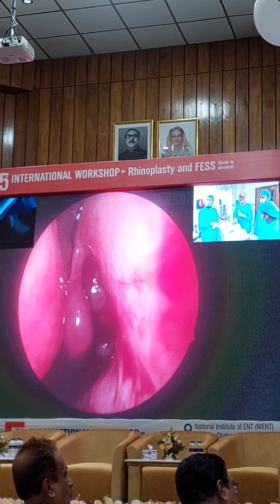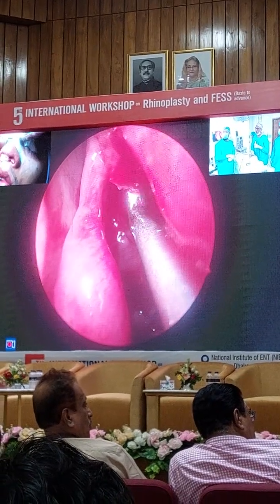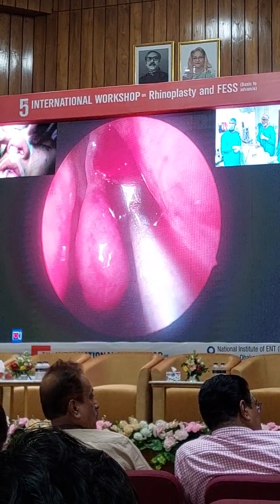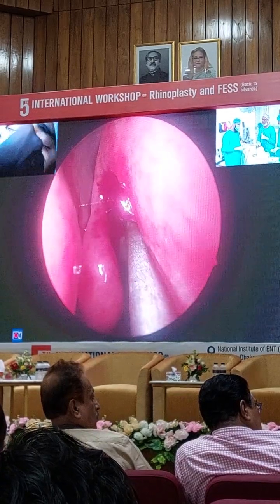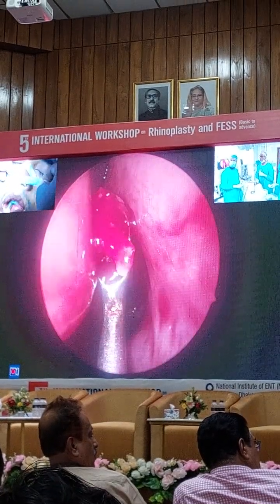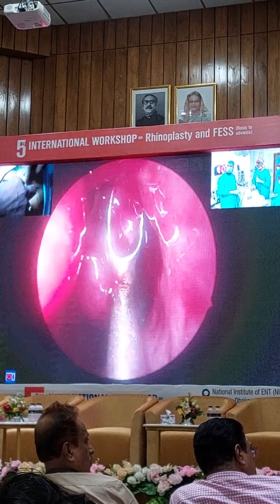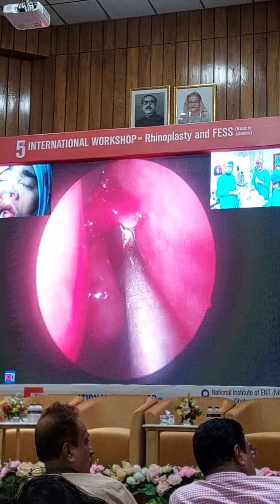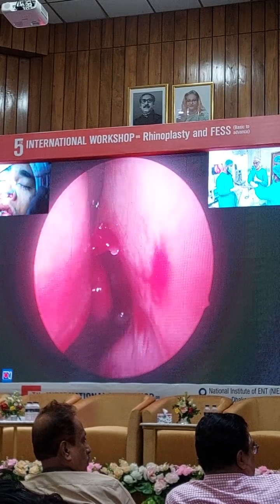Excellent. Thank you, sir. Here we have a type 3, okay? So now I'm going towards that type 3. I'm going to remove that bone here. So what we have to do to be able to work with a type 3 are two things. One, we have to widen this axilla so that I can look up easily. And two, I will need to use an angled endoscope.